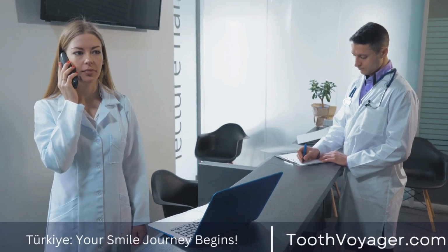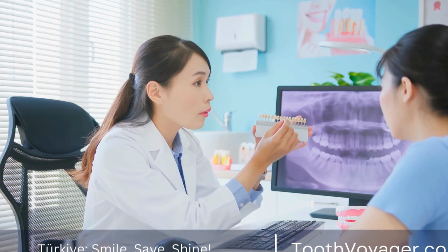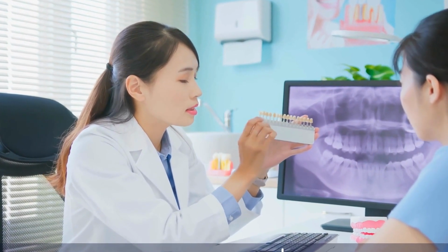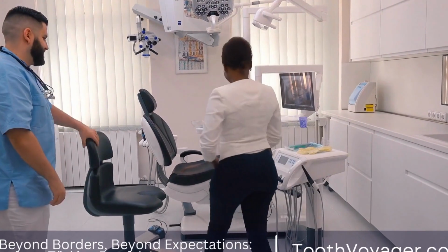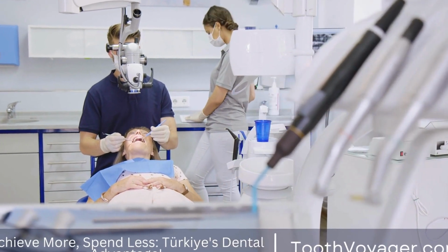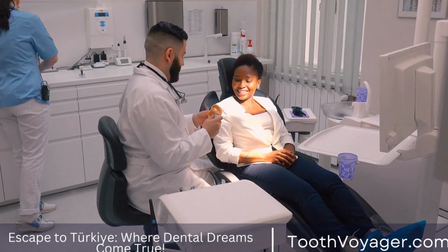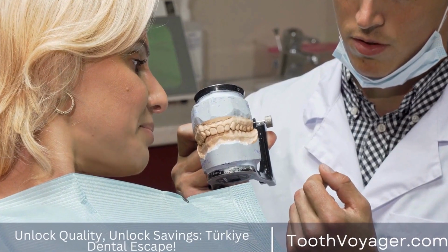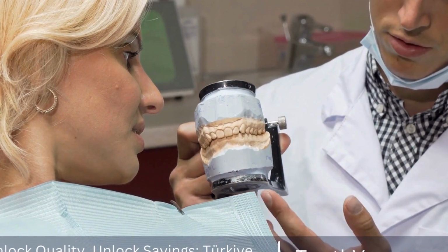What is dental bonding? Dental bonding can be described as an aesthetic dental treatment that uses a tooth-colored resin material for the purpose of repairing and restoring teeth. The resin is placed on the tooth, then shaped and molded to the size and shape desired. When the resin is in place, a special light is used to set and attach the material onto the teeth. It is an easy and quick procedure which can be accomplished in one trip to a dentist. It's also an affordable solution for the repair and restoration of teeth and is an increasingly popular option for patients.